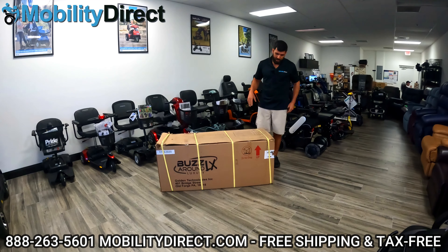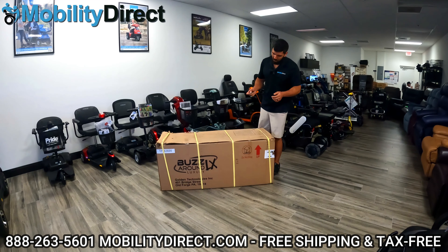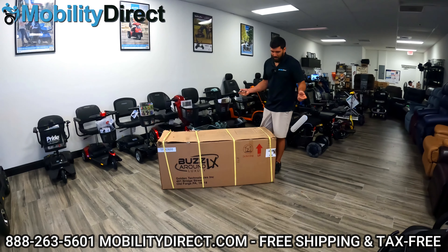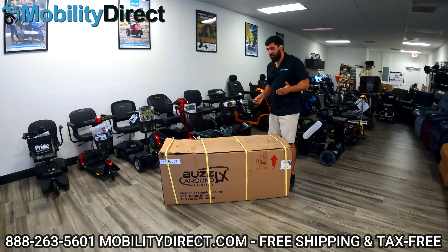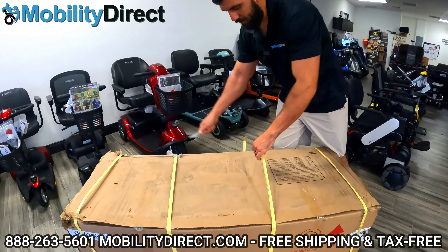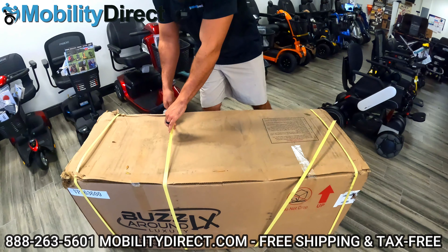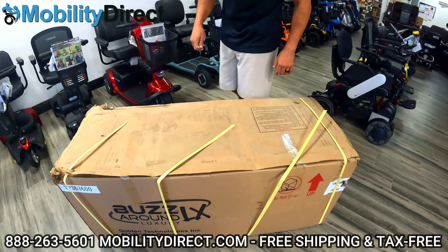We're going to unbox and assemble this. It came in yesterday. It was raining a little bit so the box is a little bit warped, but that's okay. Their products are packaged very well. You are going to need a knife and a few tools, but we'll walk you through the entire process. I'm going to start off by cutting the pallet straps. Be careful — if you have a pair of scissors, that would be the safer route. I'm just using my handy pocket knife here.